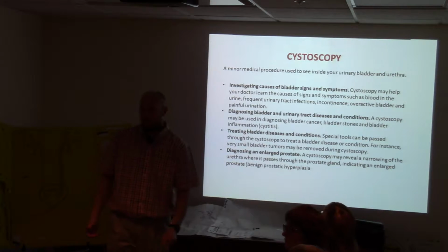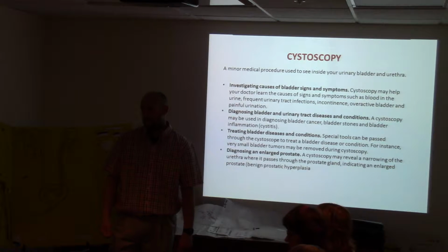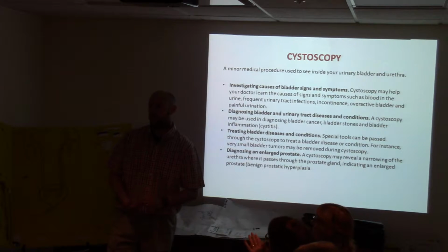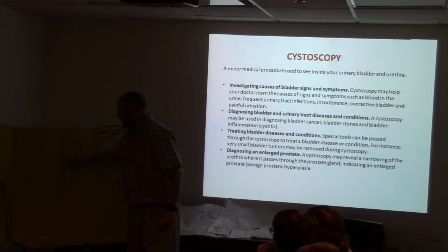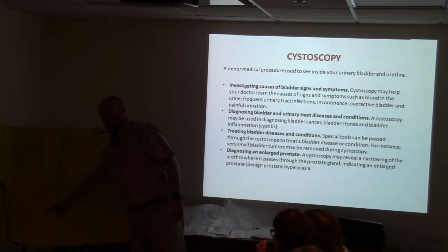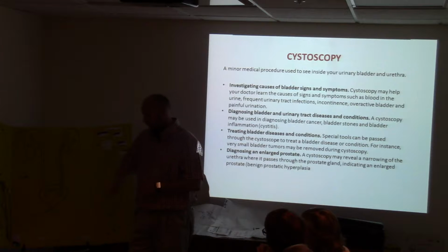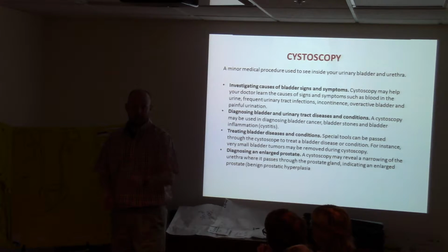dilations of the ureters. Now urethral dilation, that question was brought up last week to me. What's the difference between urethral dilation and ureteral dilation? Well, your ureters are up here and your urethra is down here. So in order to get in and access the urinary tract, urethral dilation is needed, and they use a device called a sound. It's basically a metal bar, and they increase in size. So they'll just keep putting them in your urethra until they can pass the scope into there.